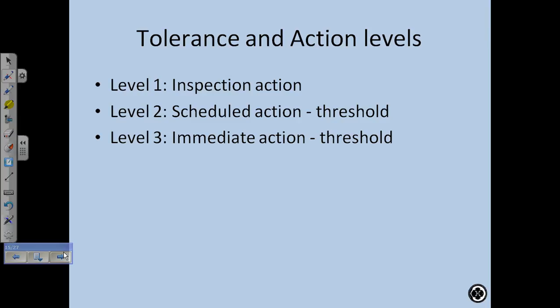What do we do? This protocol gives us a little bit of guidance on what we should be doing. If you ask one physicist, he says 2.5%, that's like 2%, it's close enough. If you ask another guy, no, I calibrate it right there. There'll be varying opinions on what you should do. It should be a little more standardized than that. We should all be thinking the same way. So this guidance document gives us these action levels.